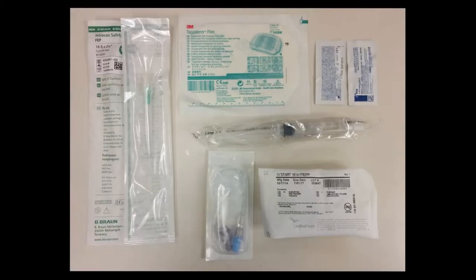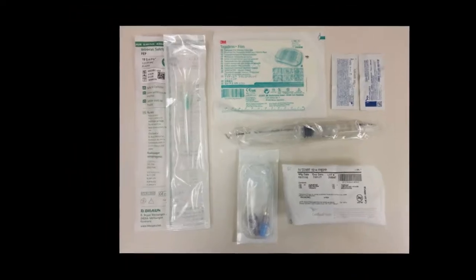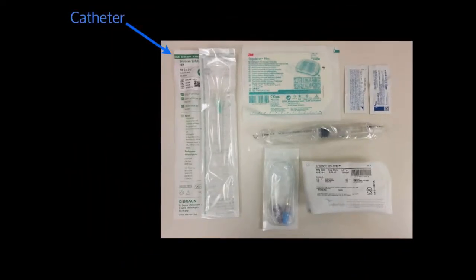Next, you're going to want to make sure that you have all your supplies ready to go. Probably the most important piece of equipment is a special catheter — this is not your standard IV catheter. You're going to need one that's a little bit longer. The ones we have are a 2.5-inch 18-gauge IV. These ones work great and are the ones I would recommend using.